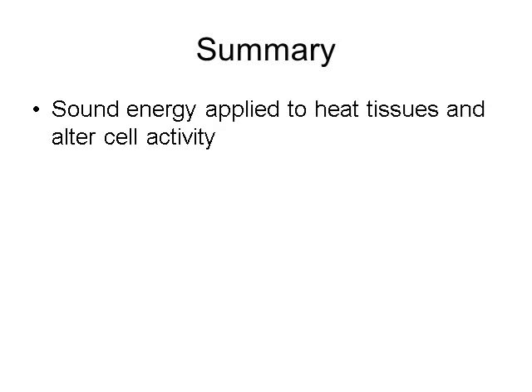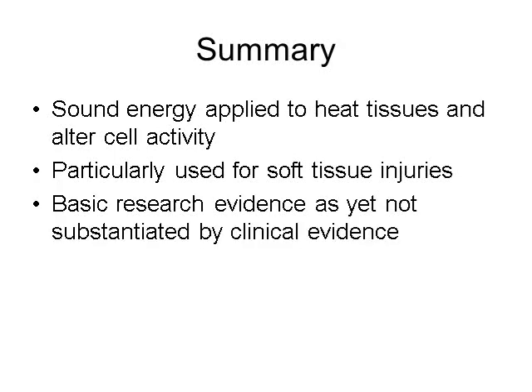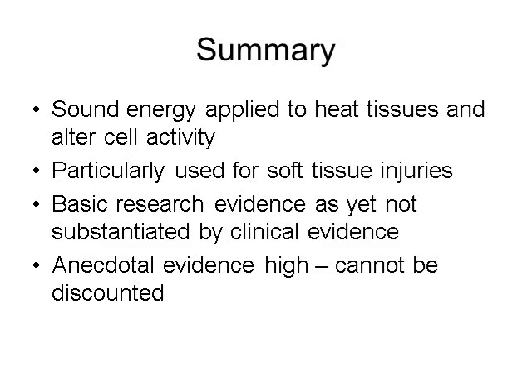In summary, ultrasound is applied to the tissues in an attempt to alter physiological processes and to cause thermal effects. It is particularly used for the treatment of soft tissues and is the most commonly used of all electrophysical modalities. Research suggesting beneficial effects in the laboratory indicates that there is a relatively sound scientific rationale for why ultrasound should work to enhance patient outcomes. But this has not been substantiated by strong clinical research evidence. The anecdotal evidence for the effects of ultrasound is high, however, and should not yet be discounted until the clinical research evidence has matured.